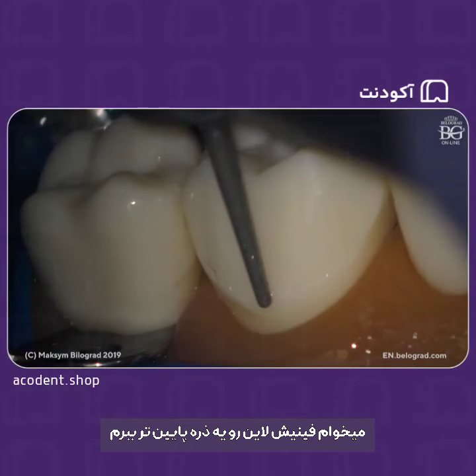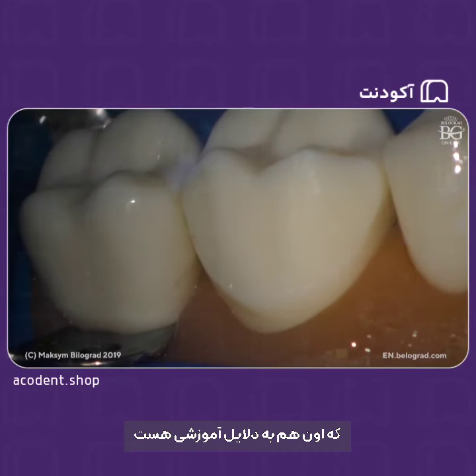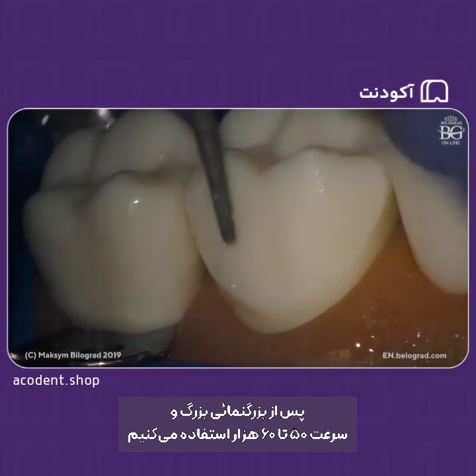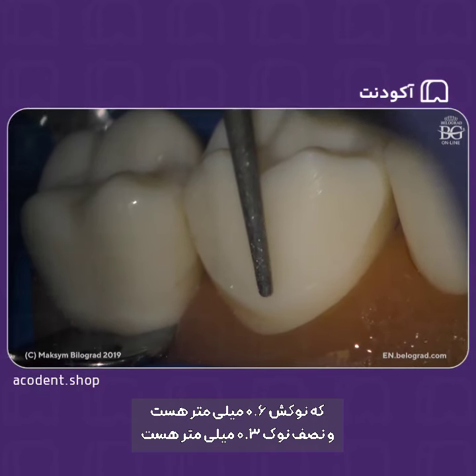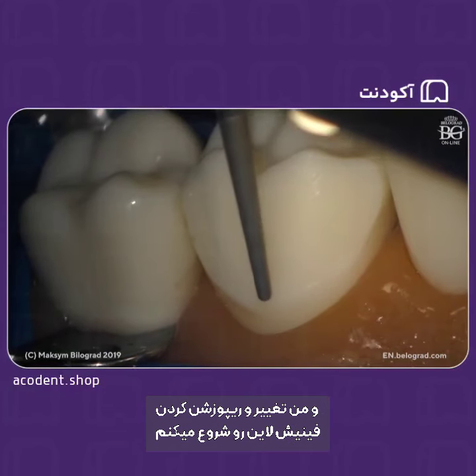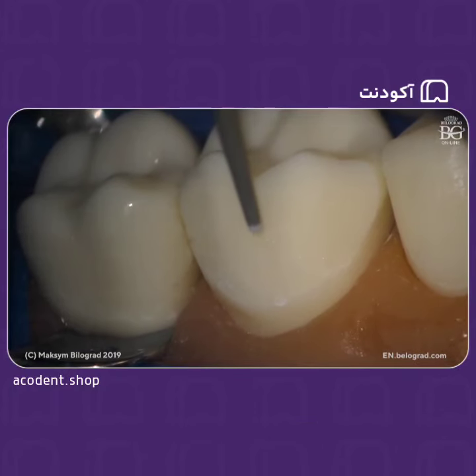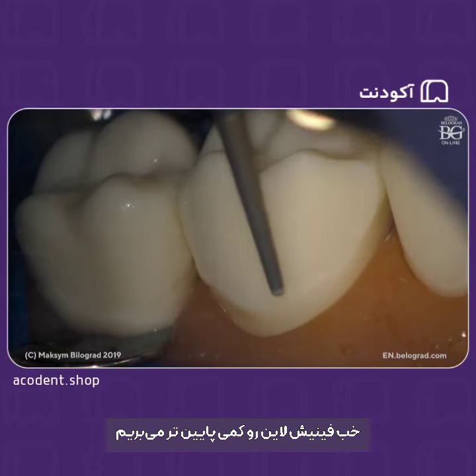I will move my finish line a little bit further down, but still keep it supragingival just for this educational purpose, so you can see what I'm actually doing. So, high magnification, 50-60,000 RPM, red diamond, burr number 14, tip is 0.6, half of the tip is 0.3, and I will start to reposition the finish line. We move it a little bit, with a little more water. During this stage, the assistant helps us with air spray. So we move our finish line a little bit down.